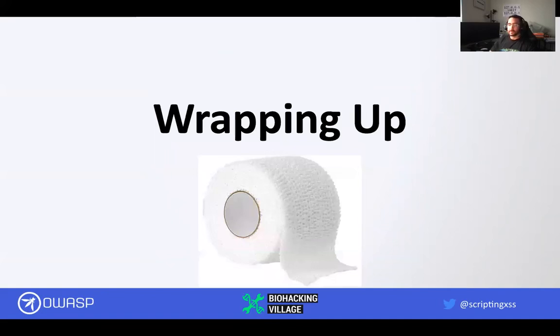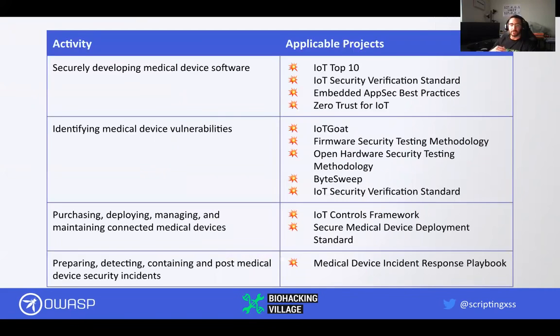Wrapping up, I wanted to provide a table to help illustrate medical device security activities and applicable projects we talked about today. For securely developing medical device software, you can take a look at the Top 10, ISVS, embedded AppSec best practices, and zero trust for IoT.